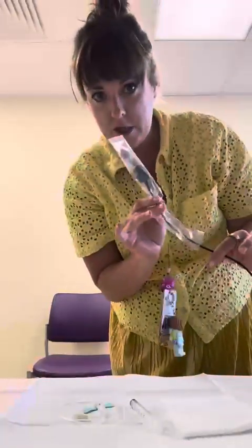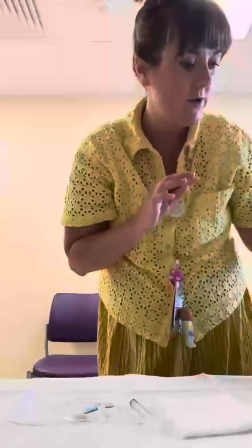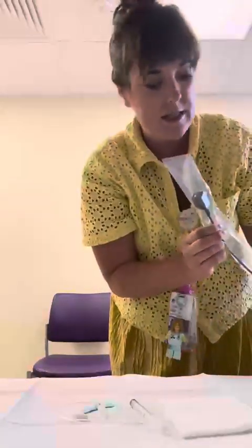These are by the Pyxis machine. There's also sterile ones if you really prefer to use those. They're a little more large and unwieldy, but you can also use a cover. This prevents blood from getting in it and just makes the thing all cleaner. And then you're going to need sterile gloves, gauze, syringe, and butterfly. So we're no longer doing one-stop shop for blood cultures. You need a separate percutaneous puncture, whether that's a venous stick, which is first line, or an arterial stick if you can't get anything venous and you need to ask someone to do that, or if the blood volume that you're needing is a lot because you're doing a bunch of other labs.